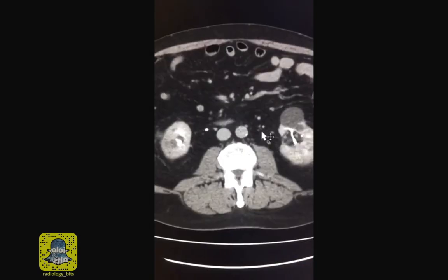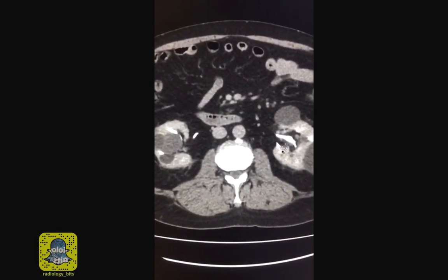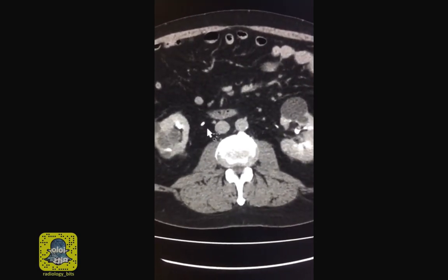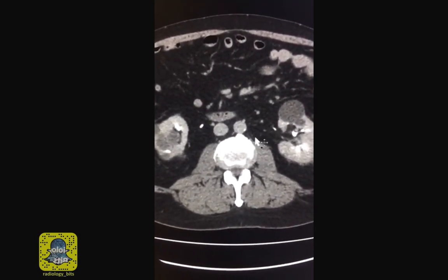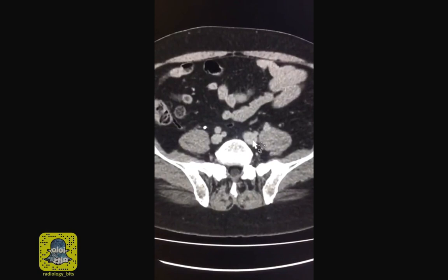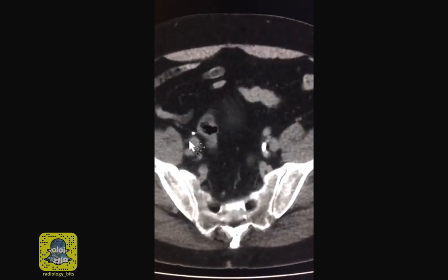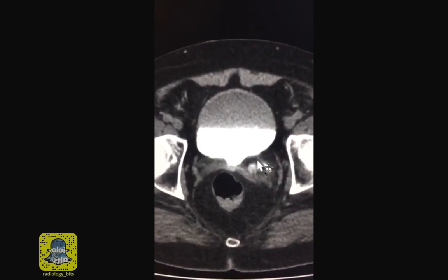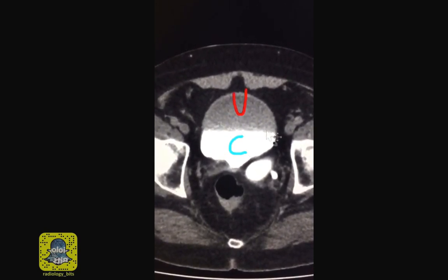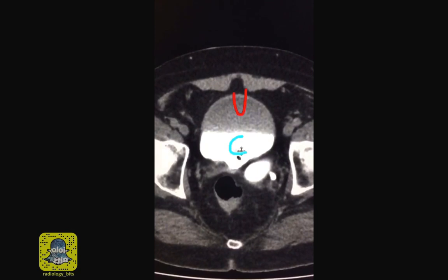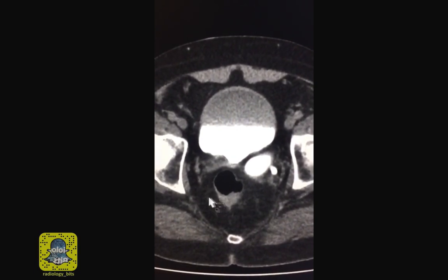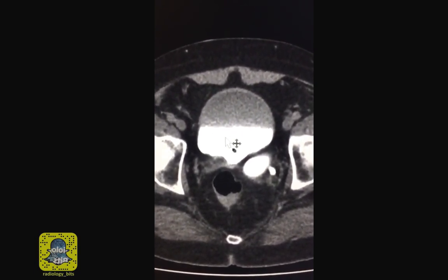That's what we did here. You see the right and left kidneys on this delayed acquisition with contrast filling the renal collecting system. The bright dots here and there represent the right and left contrast-filled ureters. Following that down, the right ureter connects here to the urinary bladder and the left ureter connects there. You also see a fluid level — this is urine and this is excreted IV contrast — because the patient is supine lying on his back, and contrast is heavier than urine.